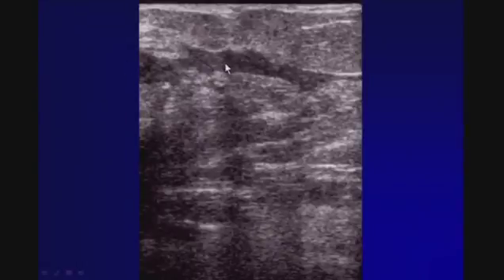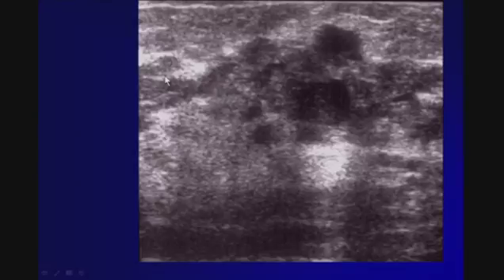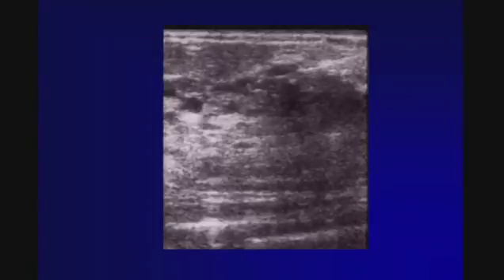Again, ductal extension, sometimes rather irregular and long, as you see here. This is a little bit different, but these are rounded areas. But notice that they're not purely cystic, some irregularity, some internal echoes. And this was an example of DCIS with microinvasion. And then we biopsied the area. We picked an area that was hypoechoic with some internal echoes to make the diagnosis.